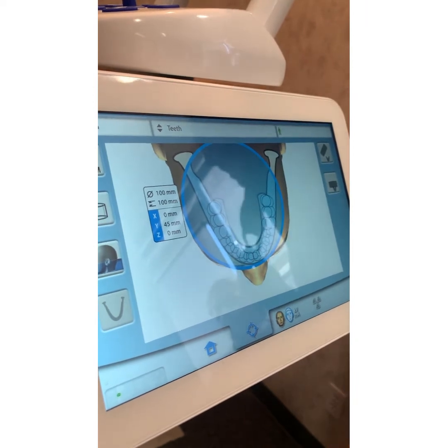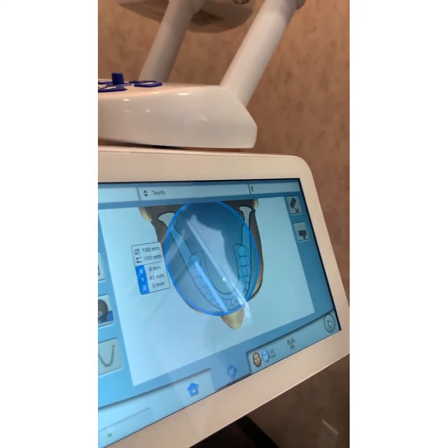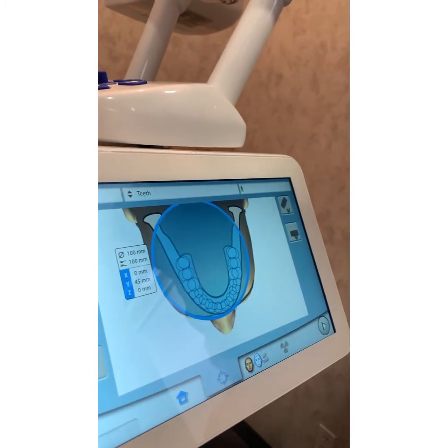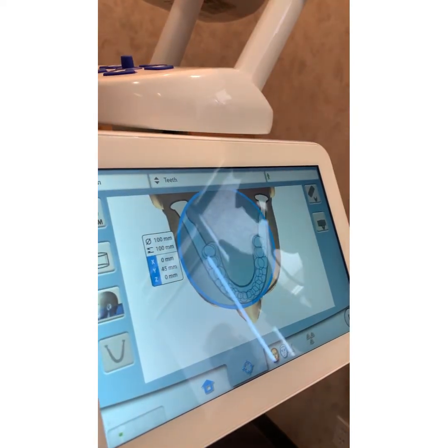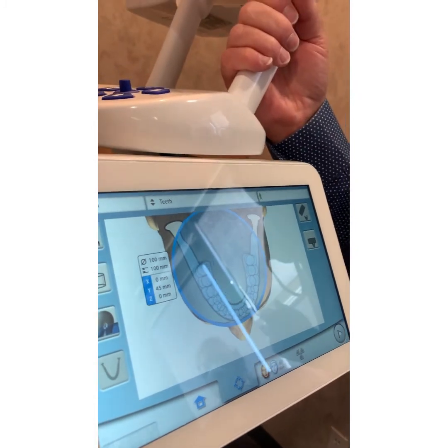Would you recommend 10 by 10? I'd recommend 10 by 10 starting out on everybody. What's nice about 10 by 10 is I can see wisdom teeth. 10 just kind of opens up. It goes centimeters farther in back, 10 centimeters in diameter, 10 centimeters high. And there's really no arches out there where you're not going to get behind the thirds.